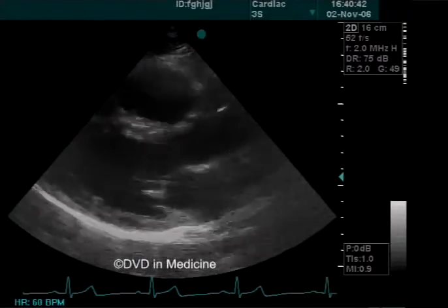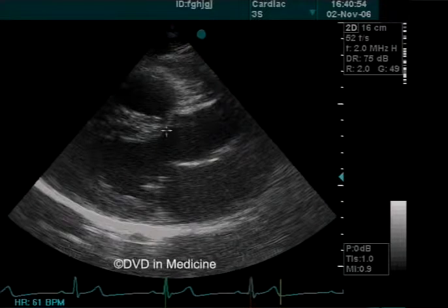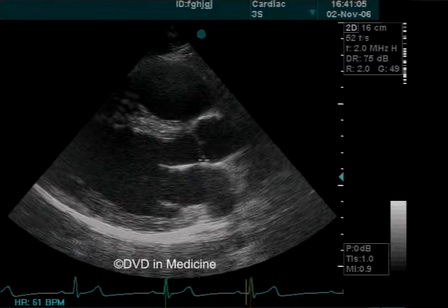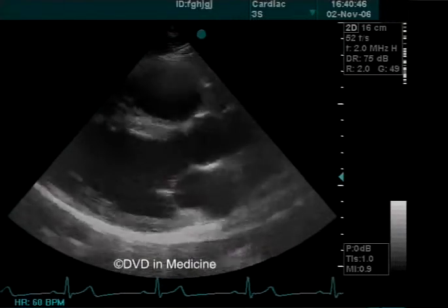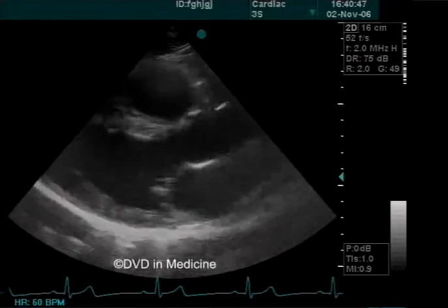In systole, the aortic valve leaflets are seen as two parallel short strips which are positioned adjacent to the aortic walls. In diastole, one will see the leaflets at the point where they close, in the center of the aortic root. One can see the aortic valve leaflets more clearly when they are thickened or in a very slim patient when there is a proper acoustic window.